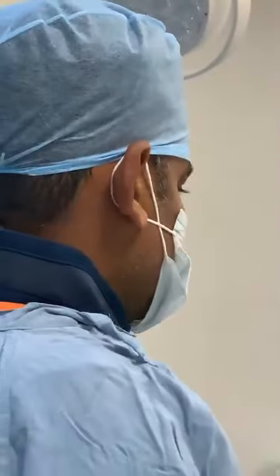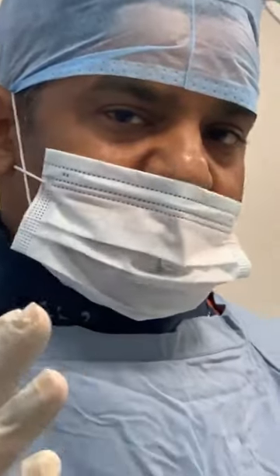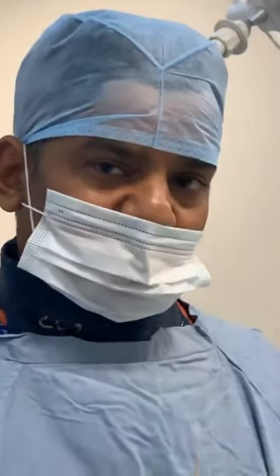Can I have one? Exact. So we will take a stent, which will be a self-expandable stent, which will be inserted, and we will ensure that the stent is placed across the disease segment. That means it goes from the normal distal to the normal proximal. Yeah.